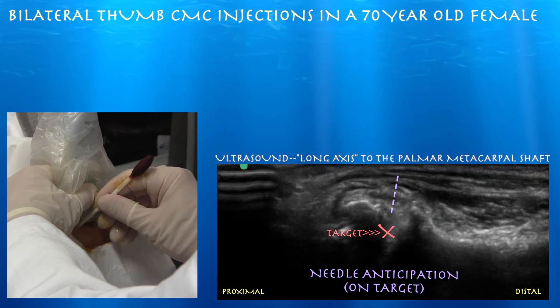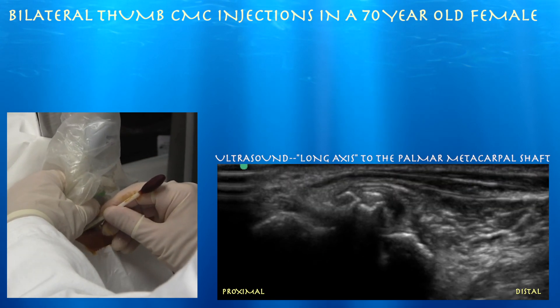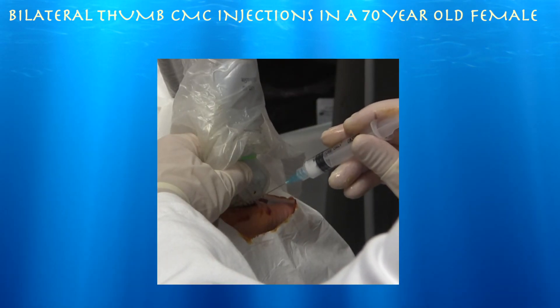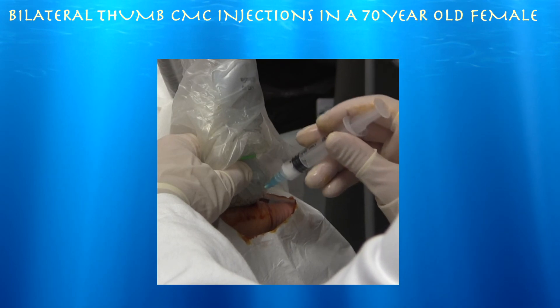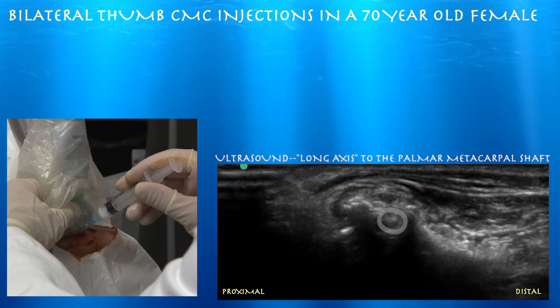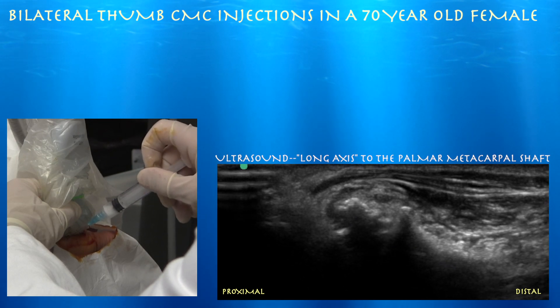And again our target — we seem to be pretty much on target for this approach. Getting right through the injection, short axis to the needle. For very superficial injections, I prefer short axis to the needle, as even with a long axis approach the needle is just going to go in a couple of millimeters. In this particular injection, short axis allows you to see the joint very clearly — you can clearly see the trapezium and the base of the first metacarpal right next to each other. Here's our needle tip right in the joint, so essentially just inject at this point.